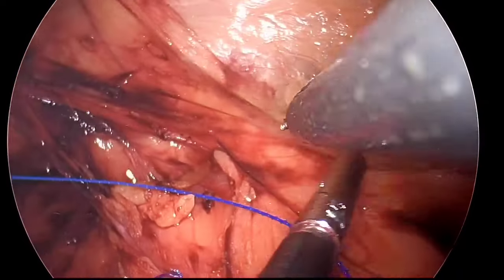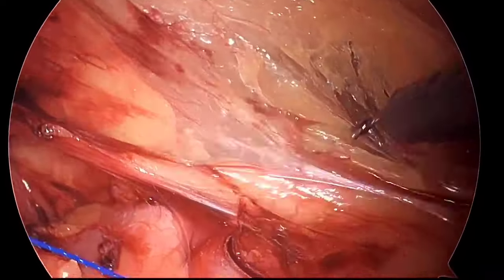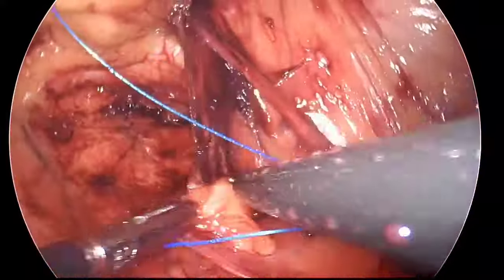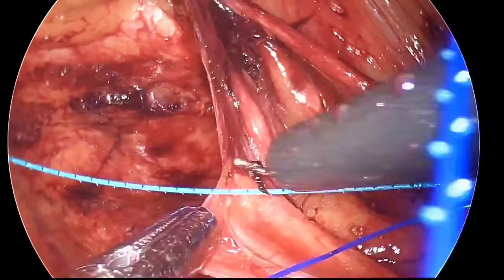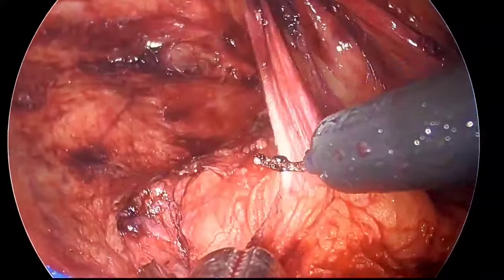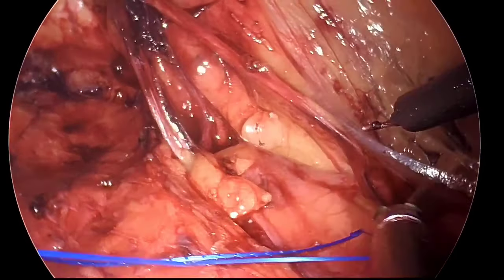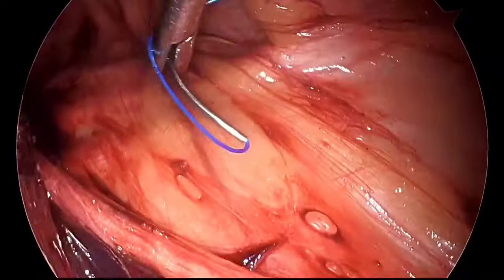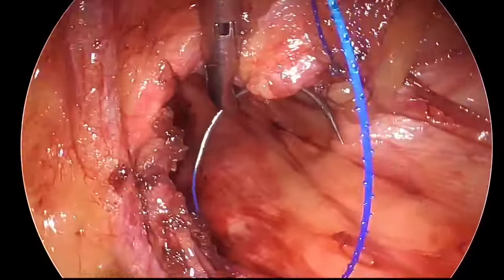Now, after repairing the peritoneal rent, I am creating further space on the lateral side. You can see the psoas muscle and the overlying fascia, which cover the nerves, the gonadal vessels and the vas deferens. Further releasing of the peritoneum from the cord structures creates adequate space all around the defect, so I can place a large mesh. In this case, I will be using a larger mesh than I routinely use for inguinal hernias. Routinely I use a 12 by 15 centimeter mesh; in this case, I will be using a 12 by 18 centimeter mesh.